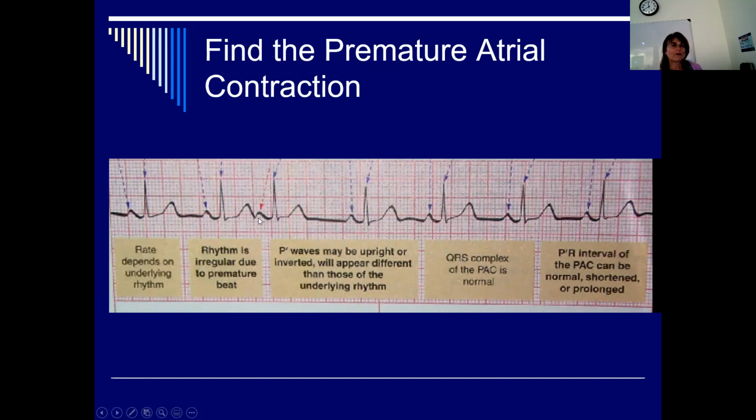When you have a premature contraction coming from the atria, it's called a PAC. After it occurs, the SA node kind of resets itself and then starts normal again. Not important for respiratory therapists, but sometimes I just want to expose you to things so it sounds remotely familiar if you hear it again. But as far as this being on the exam, no.